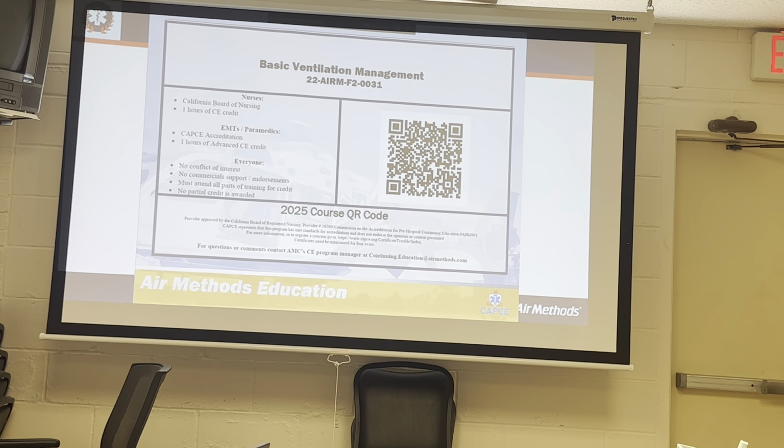And so, when you asked how do we know when to set it at 6 to 8 mils, we can look at the patient. We talked about the patient bucking the vent and that kind of thing. We can see when our patient is air hungry. So maybe the 6-foot male is the standard, like in the book, but then we still have to look at the patient. Maybe this person needs a little bit more support for their effort to draw that breath, or a little bit less, because it's hypersensitive for them. We would know that to help you get your patient settled.